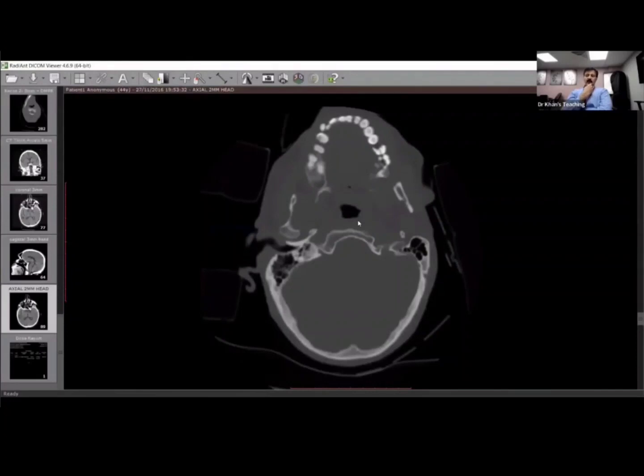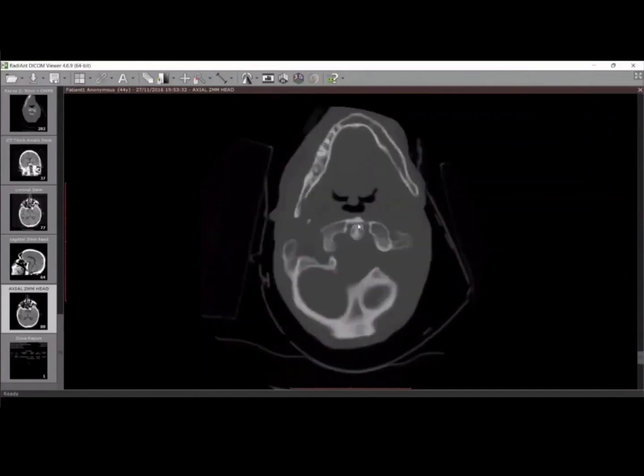In this particular case, your conclusion was that you were worried about some fractures, and you should not have said that you will pick up the phone and things like that. First of all, tell the examiner that I want to see the coronal or sagittal for the confirmation of your findings. But the key thing is your protocol.